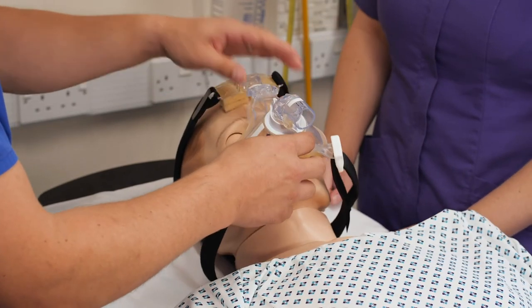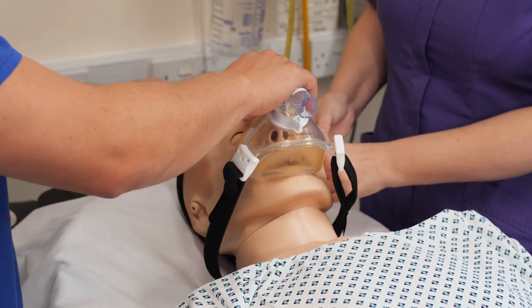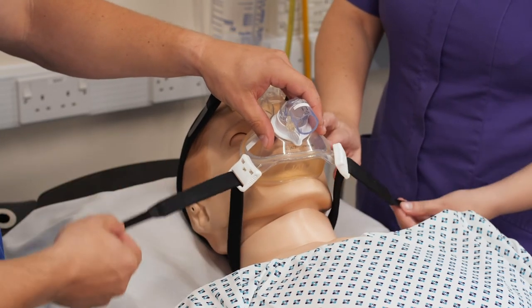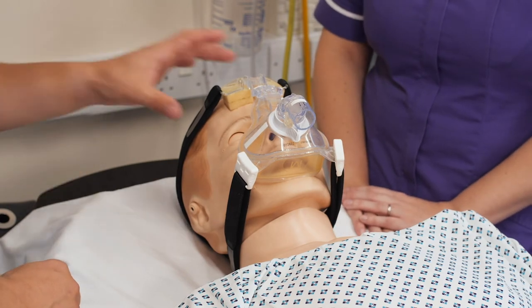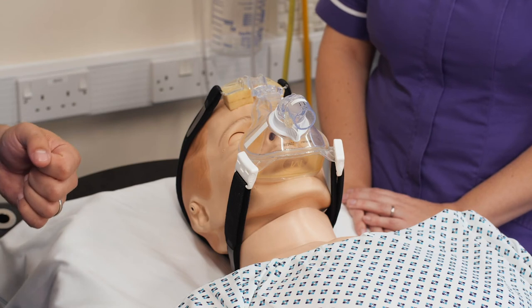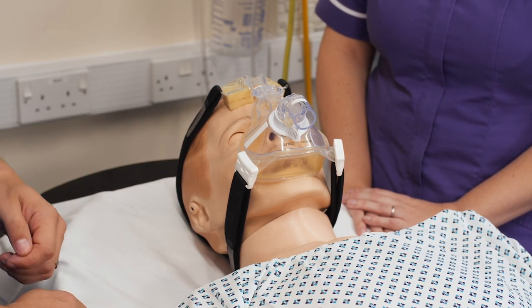Once you're happy with the location of the mask, you're then going to tension each of the straps, again trying to make sure there's even tension across all four straps to avoid any pinch points on the skin. As with the full face mask, there may well be some leakage and again the NIV systems can compensate for some leakage, so don't be too tempted to over tighten the straps.